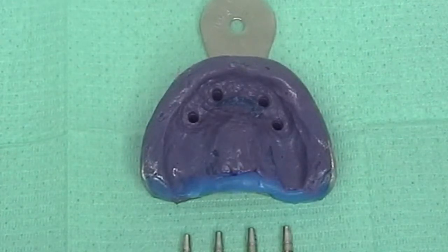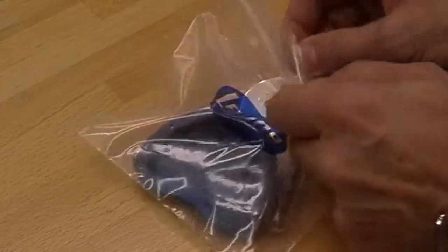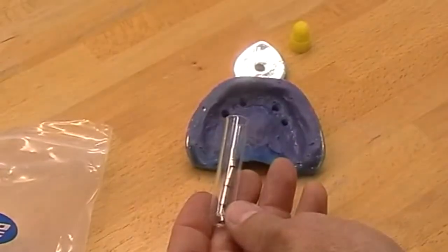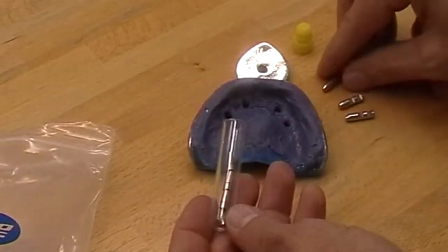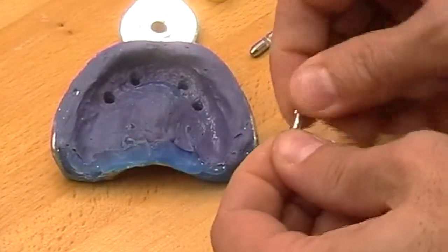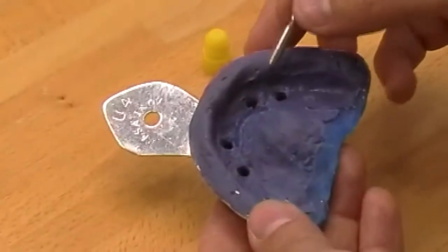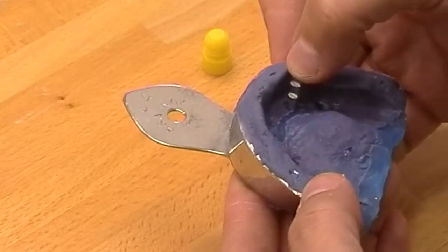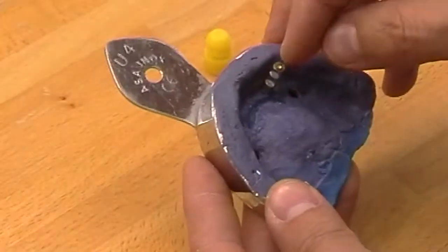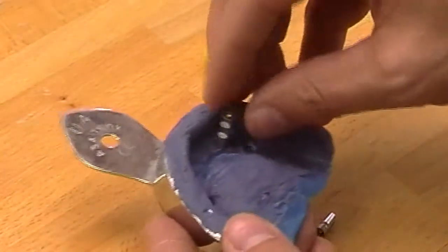The dental technician will receive the impressions and the four abutments for a screw-retained prosthesis. I screw the first abutment analog fairly tightly on the relevant transfer and reposition the assembly into the impression. You can perceive a click when complete insertion is achieved. Now we check if there is enough space between the impression material and the analog — here it is fine.